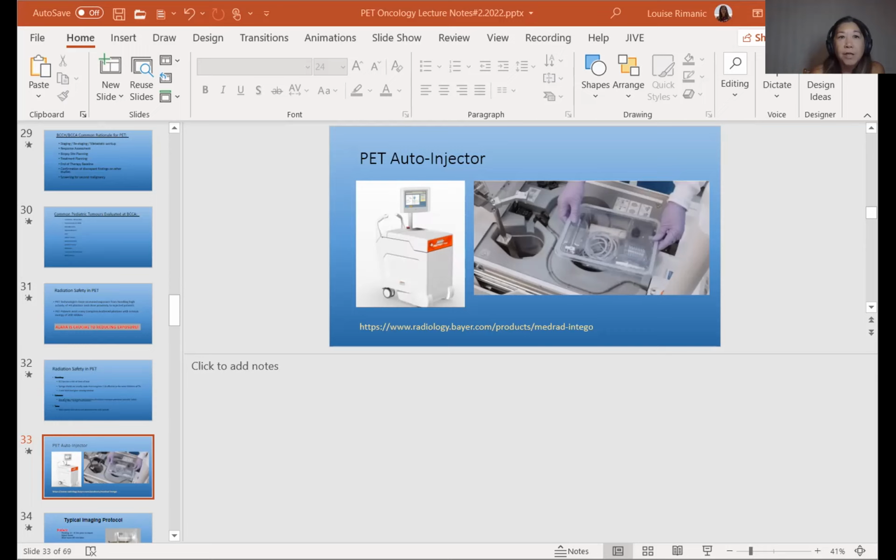In terms of the instrumentation, the newer PET-CT scanners are just coming out with better and better resolution. There's also the introduction of PET-MRI, which a couple of years ago they kept saying can't be done, and yet it has been. While we don't have a clinical PET MRI in BC at this point in time, I believe the UBC Brain Research Group were trying to fund a research PET MR. I'm not sure if they've been successful yet.